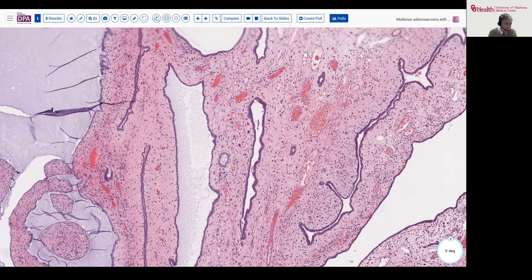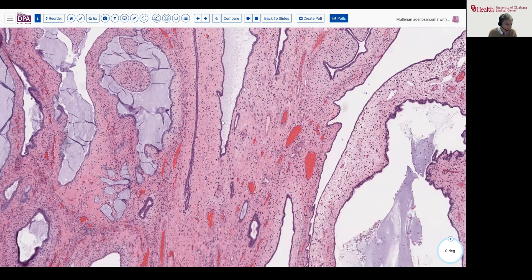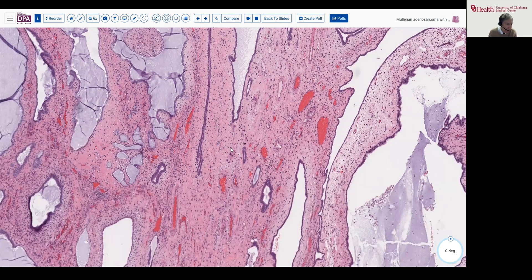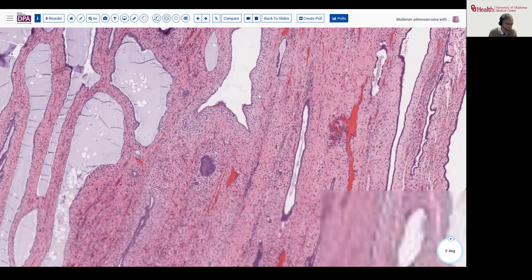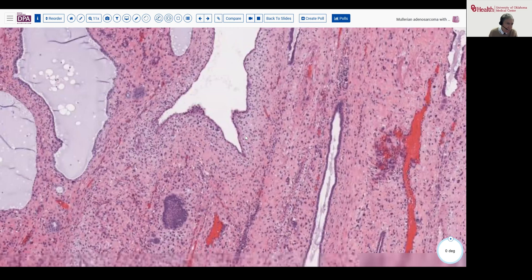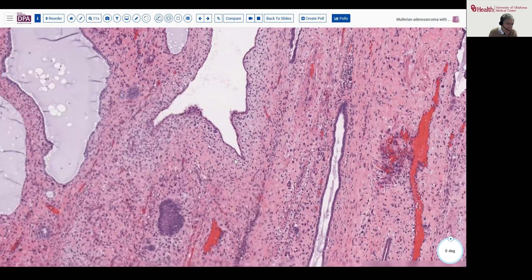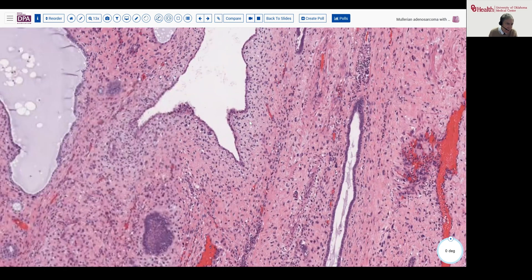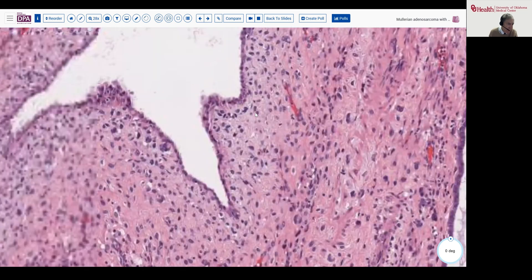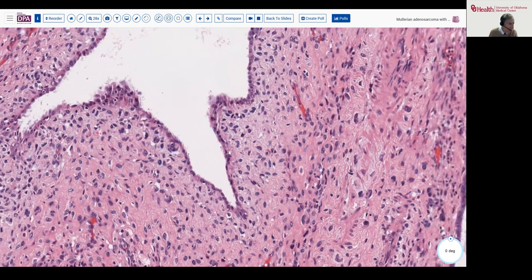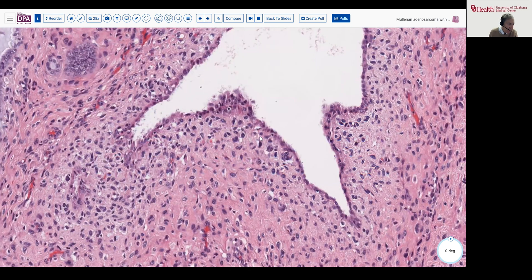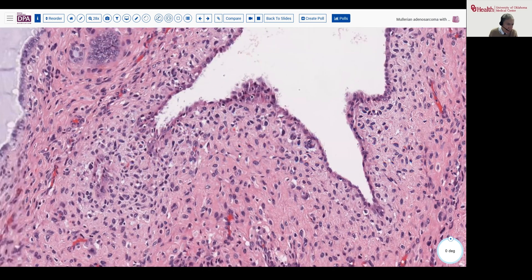We'll look here at the deeper tissues and take a look at some of these more cellular areas here. And I think you can see, again, still some atypia. Occasionally, we might find mitotic figures, certainly some pyknotic cells, a degree of atypia that really should not be here in the stroma.